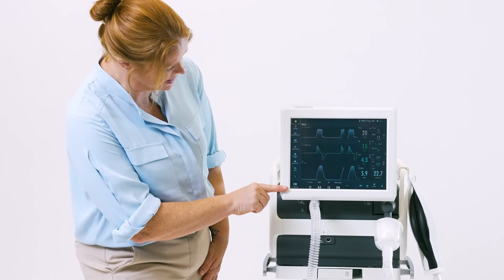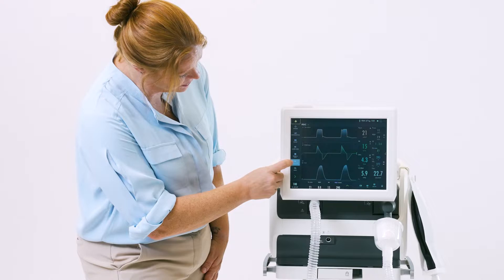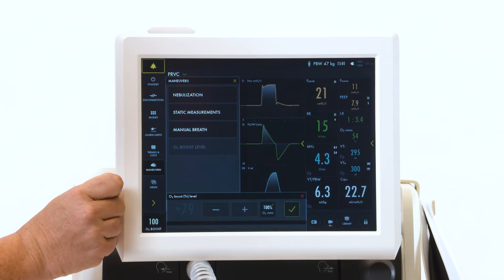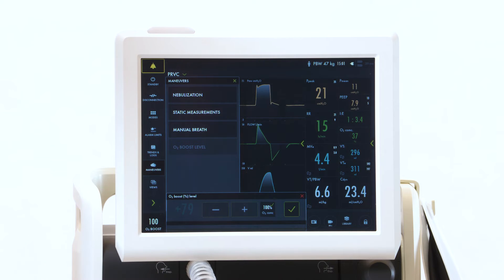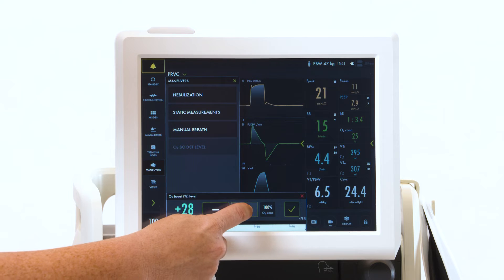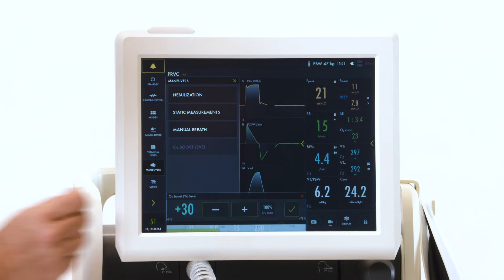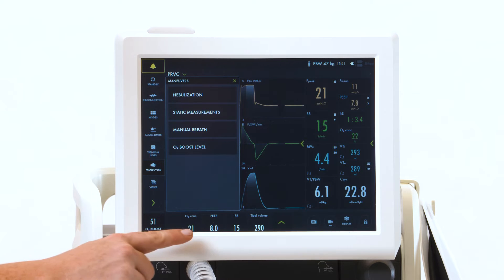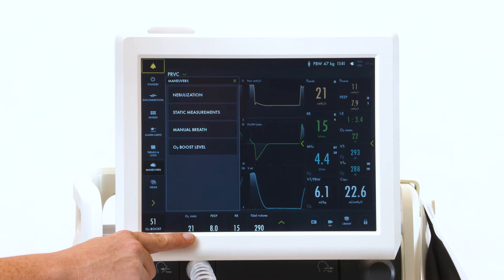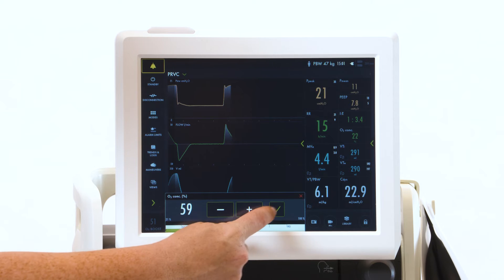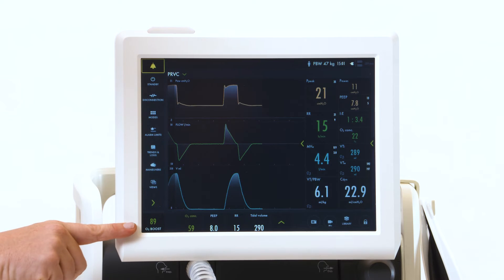If you'd like to adjust that, go to your maneuvers and select O2 boost level. Currently, you can see it is locked in to 100%. You can unlock it and adjust this to whatever you would like. When you hit the check mark, it will then set your O2 boost at that amount above your set FiO2. As you change your oxygen, your O2 boost level will automatically change.